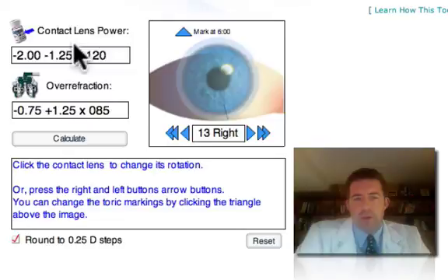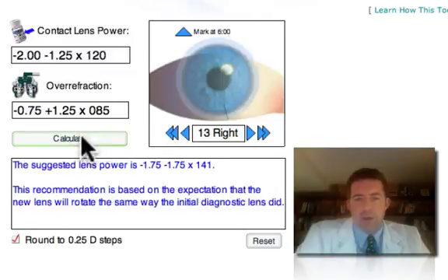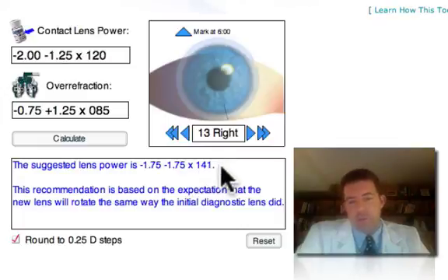So once you input these three pieces of information, hit calculate, and it'll show you the results of a cross-cylinder calculation. And in this case, I would use minus 1.75 minus 1.75 axis, I would choose 140 since contacts don't usually come in 141. And I'd order this trial lens and try it on the patient's eye. Cross my fingers and hope that this would be the lens for this patient.